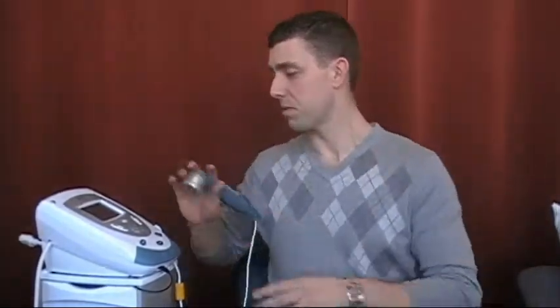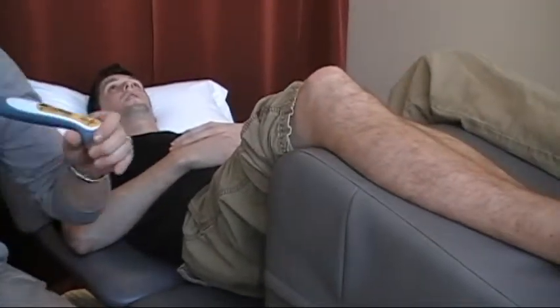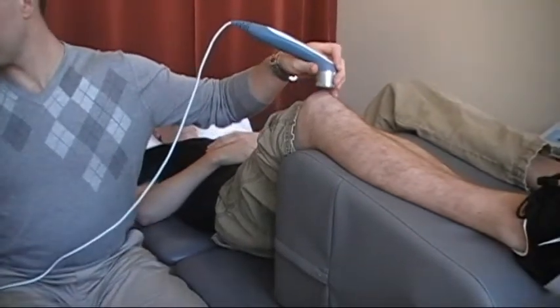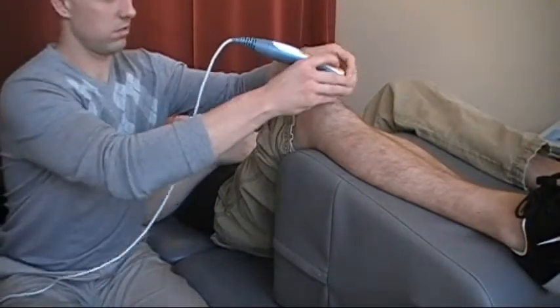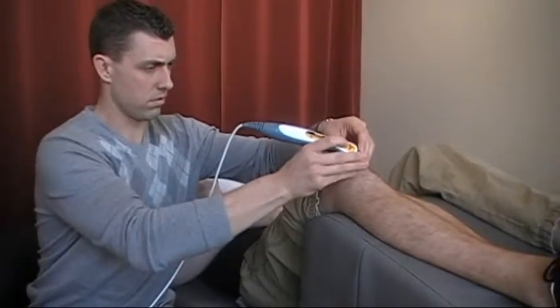So this is what the unit looks like. We've got a sample patient here who will demonstrate what the treatment looks like. When we start it, we're going to do a patellar tendonitis, or a jumper's knee.